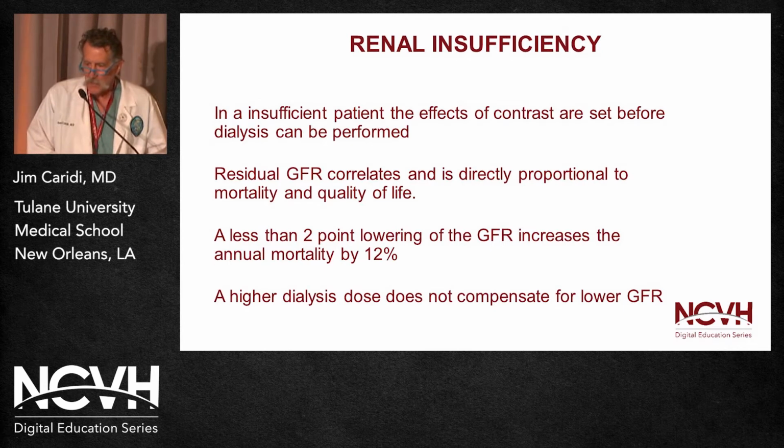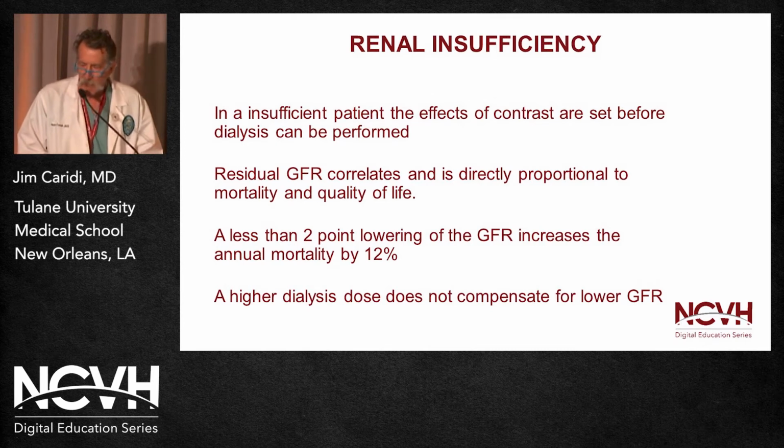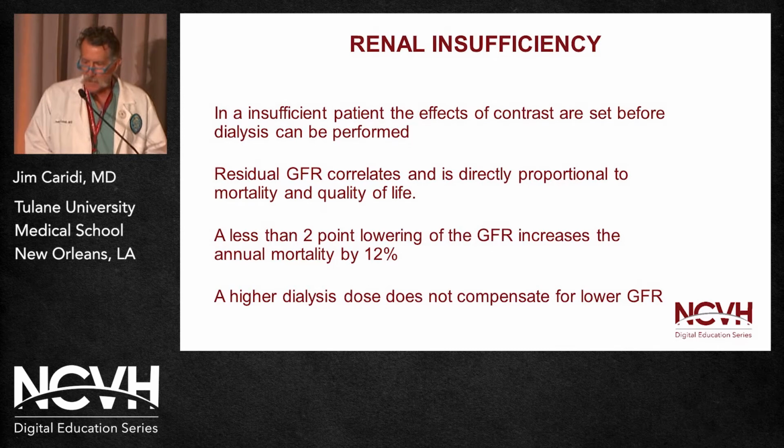And we know with renal insufficiency, a lot of radiologists will tell you, oh, we're just going to send them to dialysis. By the time they make it to dialysis, think of how many times that contrast has gone through the kidneys, and it's really a misimpression that you can get rid of this contrast through dialysis. And if you look at the residual GFR in a lot of these patients, a drop of 1 point in the GFR increases the mortality of these patients by 12%.